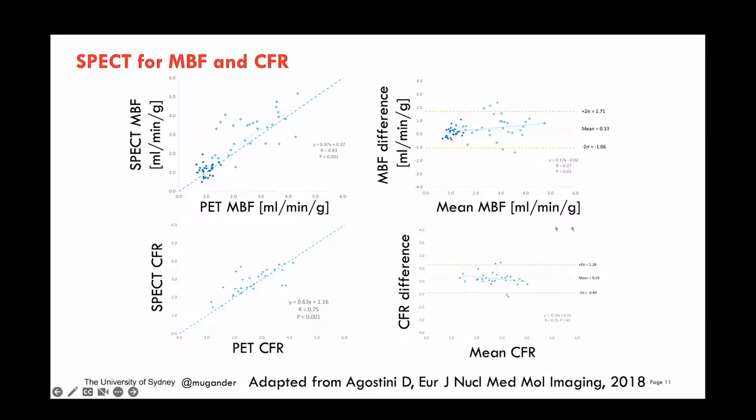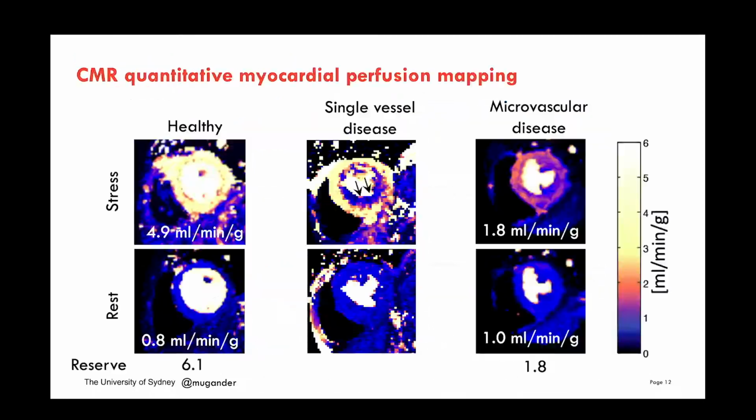So the work in the SPECT world has been promising with studies like this one, but it's not quite there yet, and there's some caution in the field, and it's not used routinely just yet. Certainly a research tool and evolving.